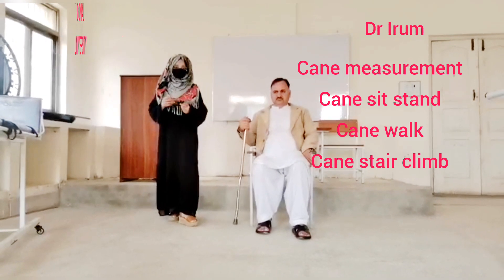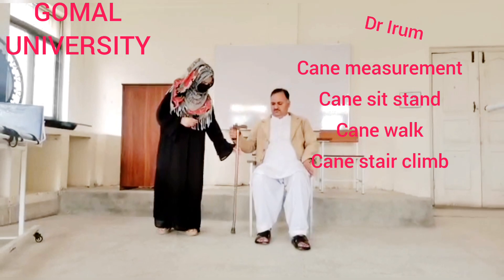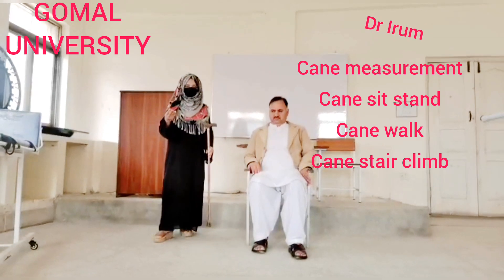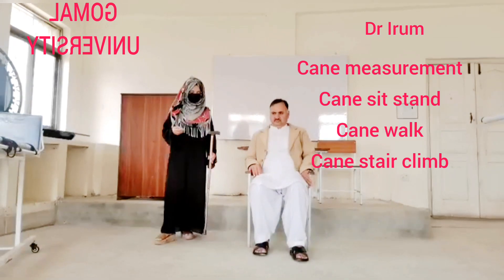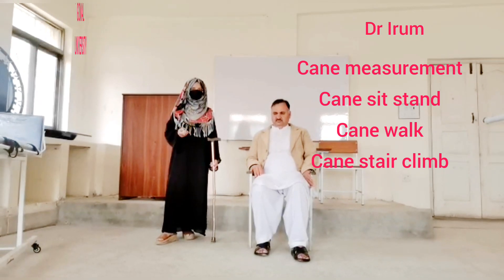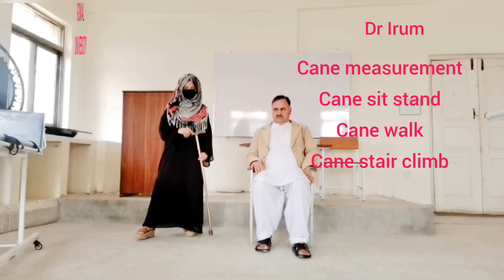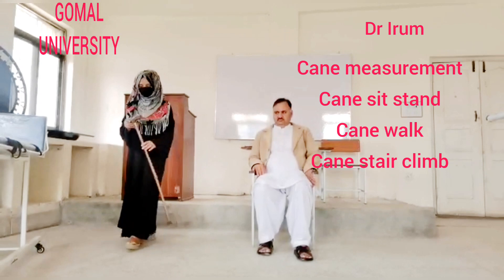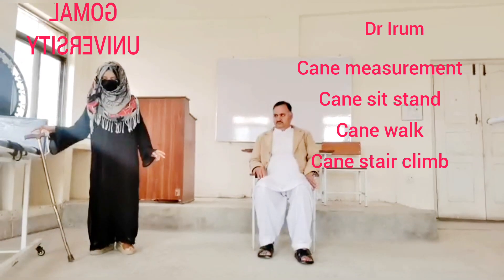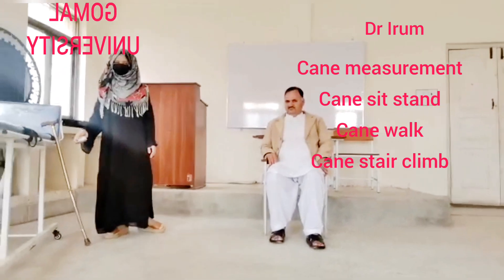First of all, we ask the patient to stand in a straight position, from which we take the cane measurement. Cane measurement is taken from the greater trochanter to the floor. For a cross-check, we take another measurement: the patient stands straight with the elbow flexed to 15 degrees, and we measure from the wrist level to the floor. If both measurements are the same, it means we have taken the measurement correctly.